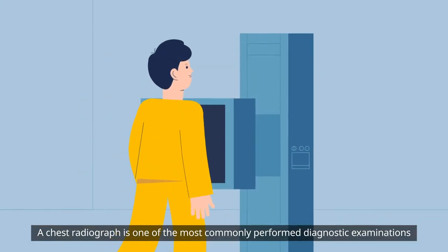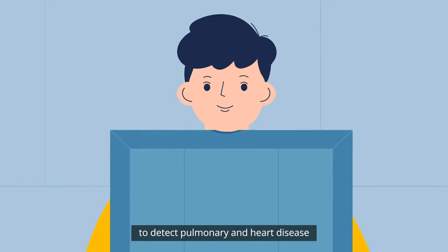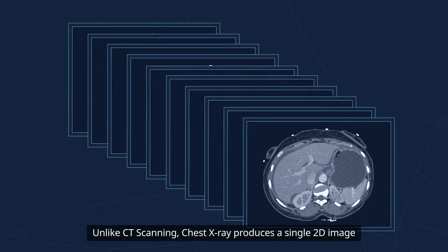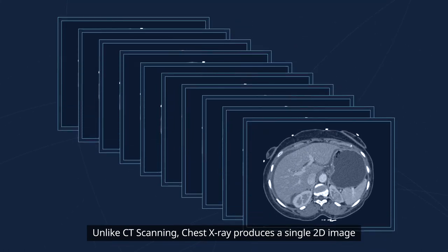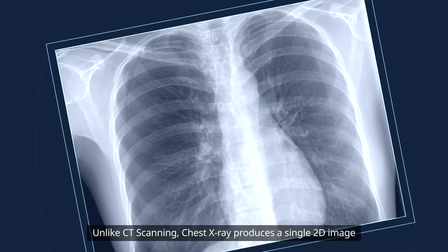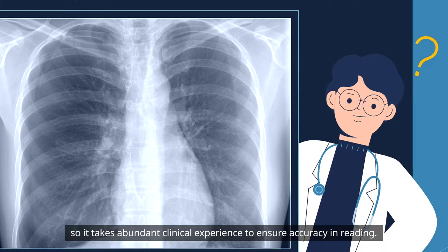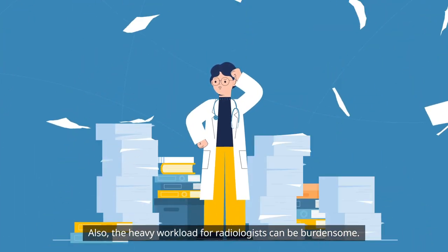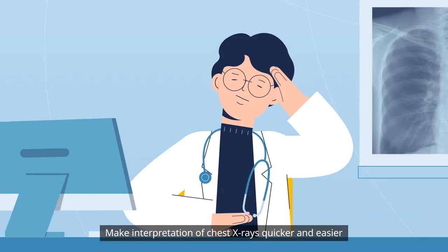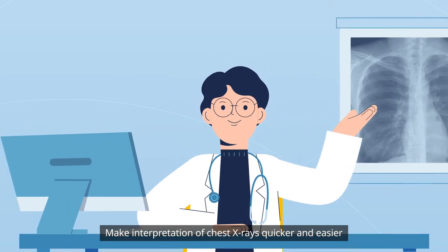A chest radiograph is one of the most commonly performed diagnostic examinations to detect pulmonary and heart disease. Unlike CT scanning, chest X-ray produces a single 2D image, so it takes abundant clinical experience to ensure accuracy in reading. Also, the heavy workload for radiologists can be burdensome.